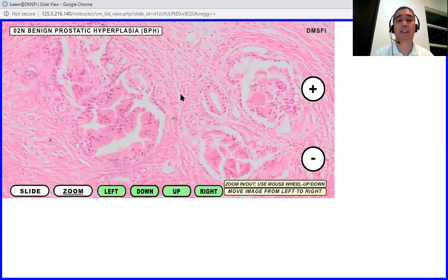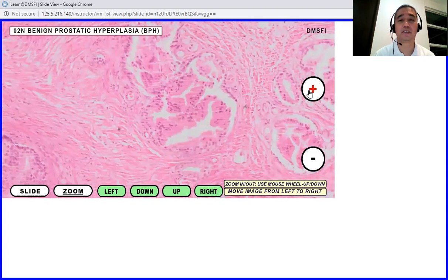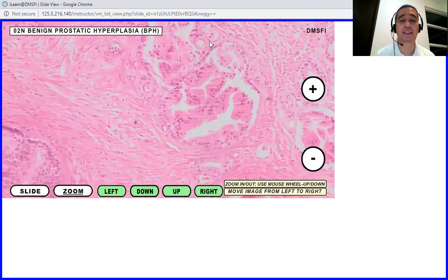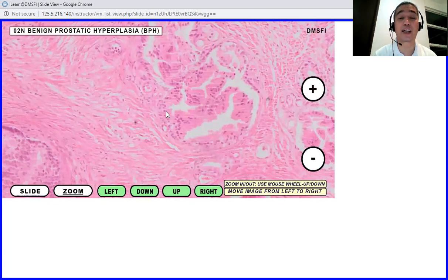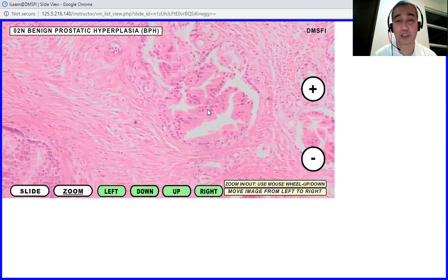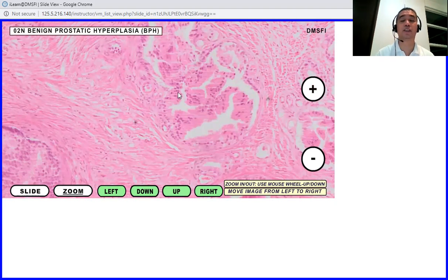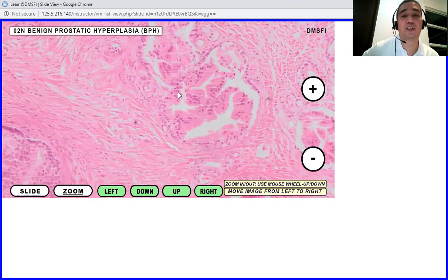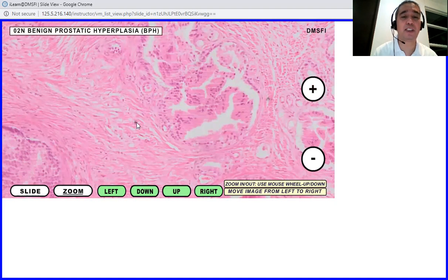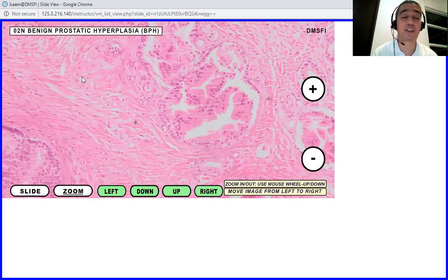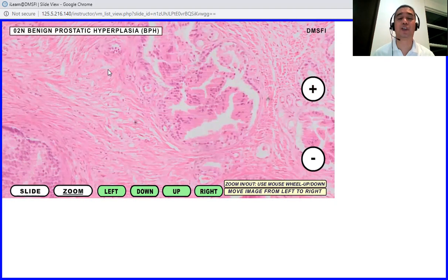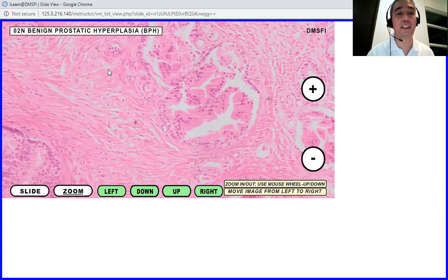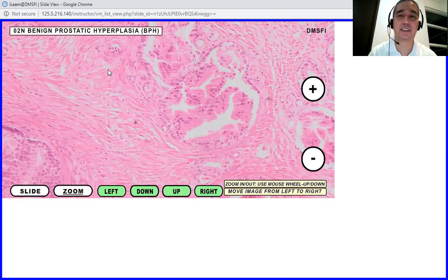In the presence of hyperplasia like this one, the glands or the acinar structures tend to be larger and there would be overcrowding of the cells. Notice that there's projection into the lumen, there's stratification of the nuclei. These are changes that would be attributed to hyperplasia. So aside from hyperplasia, the benign prostatic hyperplasia would also manifest with hypertrophy because of this fibromuscular stroma. Because they do not increase in numbers, they increase in their size.